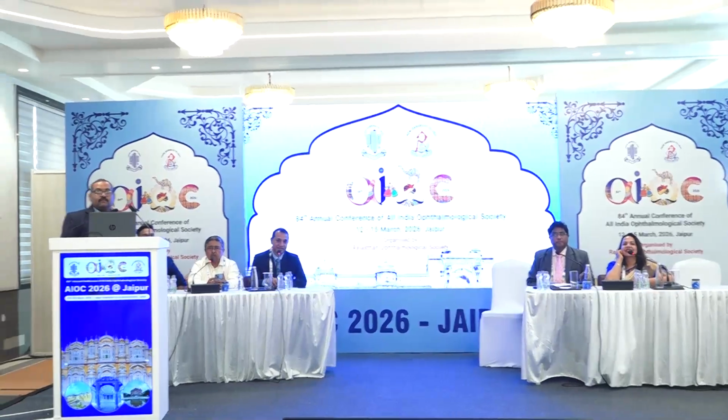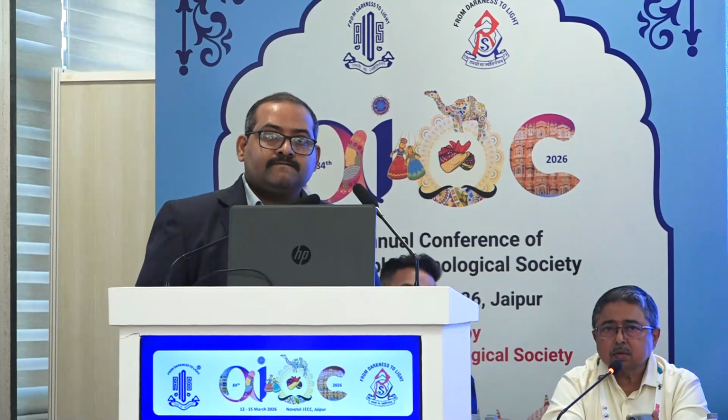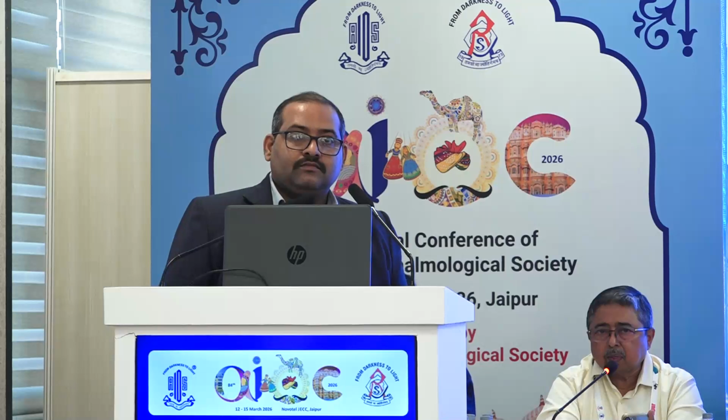Yes, please. So we are talking about IOL power calculation. In adults, usually it's optical biometry that we do to have everything accurate. Can the same be applied in children, where the biometry is done under GA with a manual scan? Because the results are going to be different. They are not focusing on anything. They are under GA, so it will be so subjective. You do, there will be a difference in the axial length. So can that same platform be applied in children? No, in children you can't.